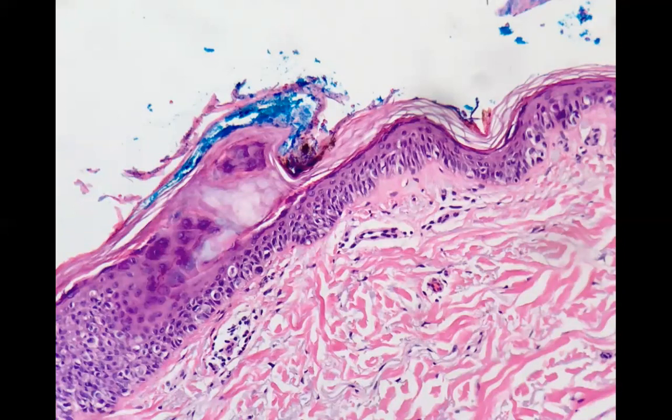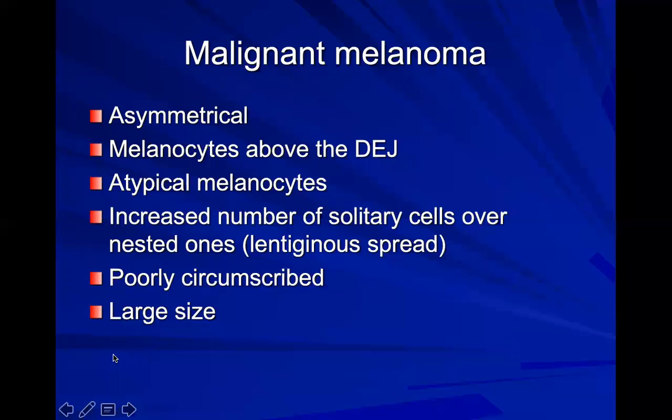On the last one, someone might have called it early melanoma versus atypical intraepidermal melanocytic proliferation, which could be evolving melanoma. That would be the distinction in the name. This, most people would agree, you're at lentigo maligna melanoma. Lentigo maligna meaning a lentiginous proliferation. Okay, so malignant melanoma has a lot of these atypical features.